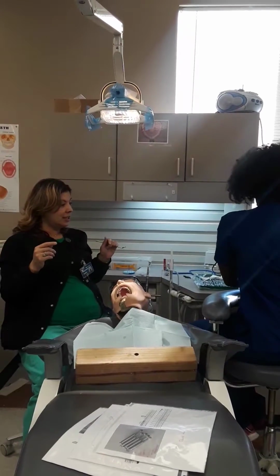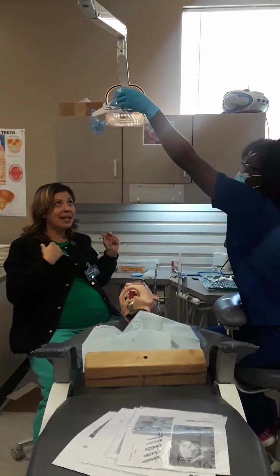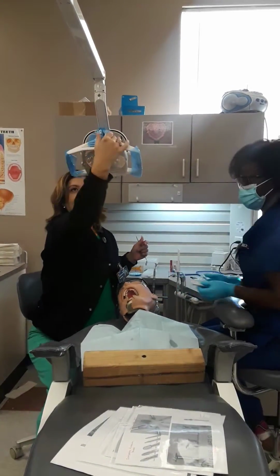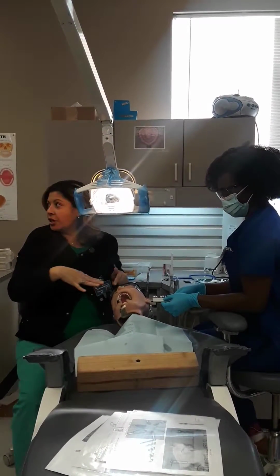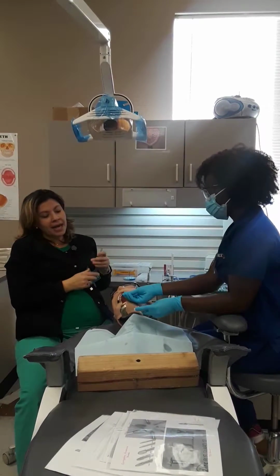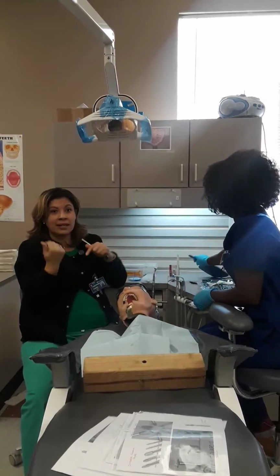Shade guide. So she's going to wet the shade guide, because the shade will look better if it's wet, because our mouth is wet. And then she's going to turn off my light. In my office, you turn off the light. Some offices, you will turn the light away, but I'll show you the difference. If she turns the light away, you see this yellow hue, you're going to get it down here, so you're going to get a false reading. So in my office, always turn off the light, and then you can get your shade. So she's just going to match the shade, because if we're working on front teeth, you want your shade to match, right? You don't want to see yellow to white, or the other way, white to yellow.